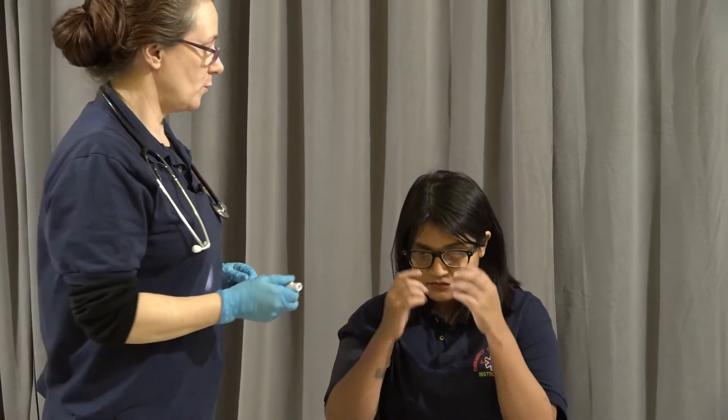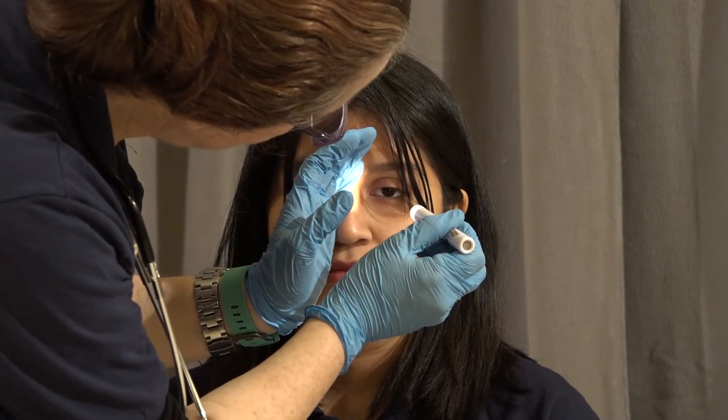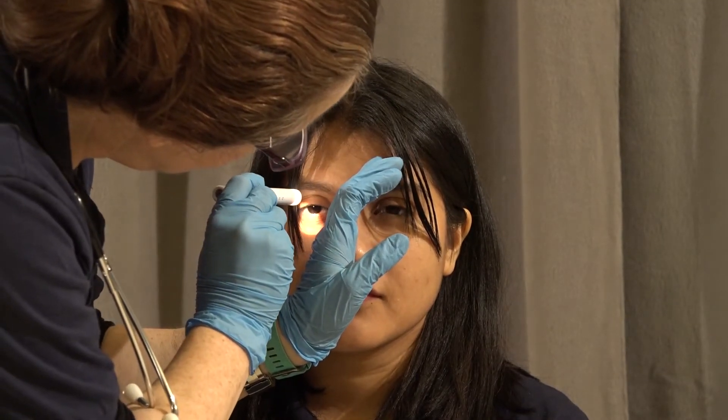I'm going to move on to her pupils. She's wearing glasses, so I'm going to ask her to remove those. I'm going to cover the eyes, move in from the side, and watch the pupil respond. I'll repeat it on the other side. The eyes should constrict as I point the light in, and they should act together in a symmetrical way.